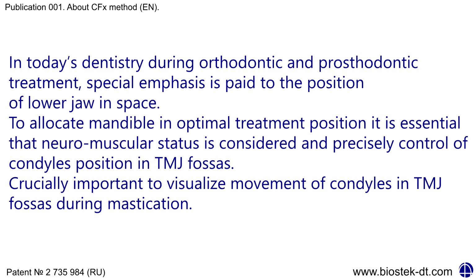In today's dentistry, during orthodontic and prosthodontic treatment, special attention is paid to the position of the lower jaw in space. To allocate the mandible into an optimal treatment position, it is essential that neuromuscular status is considered along with precise control of condyles position in TMJ fossas. It is crucially important to visualize movement of condyles in TMJ fossas during mastication.